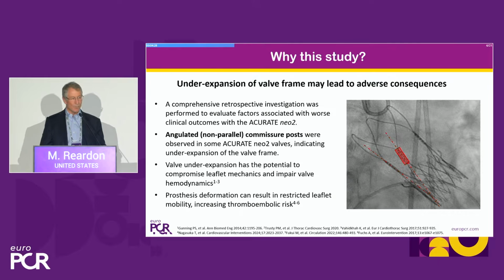And so we went back and said, well, why would this be? The first thing we did was we sat down with some engineers from Boston, and we went back over all the arteriograms, and we found some that were underexpanded. And then after talking to the FDA, we went back and got an independent core lab to look at this. And so we wanted to have a comprehensive retrospective investigation to see what was going on here.